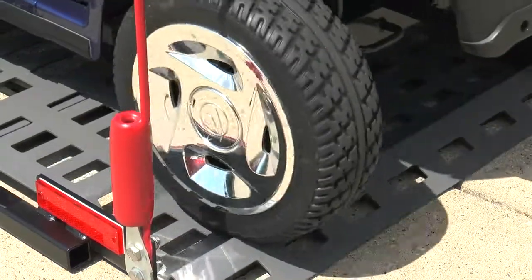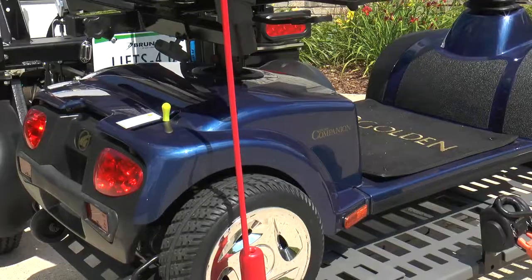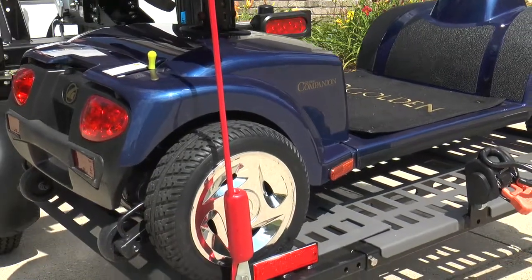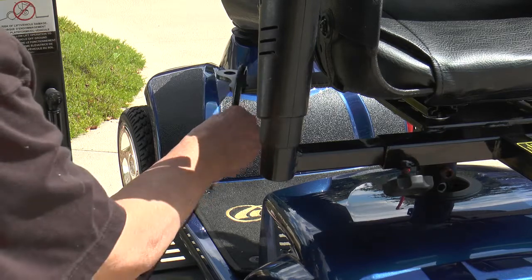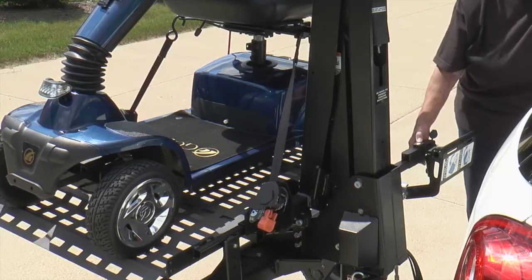Drive your scooter or power chair onto the ramp from either direction, press the button to operate the lift, and once the platform is fully raised, easily secure your scooter or power chair with the one-hand operation retractable belts.